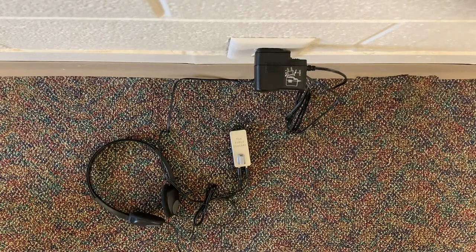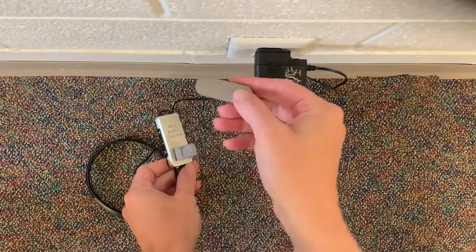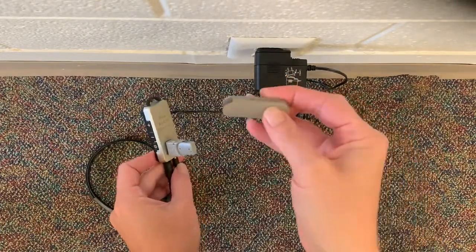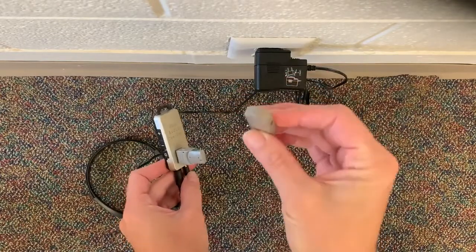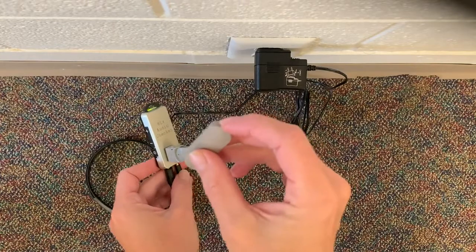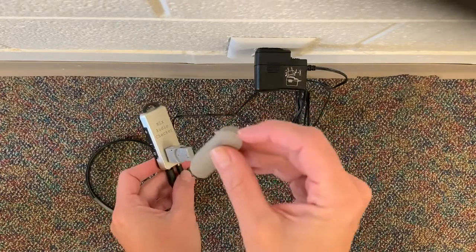You are looking at the audio checker, which is a good way to check if the sleeve for the Medel processor is working. This particular one is called the Roger 21, so it does not have the Roger X on the bottom, but you can do the same thing with the one that does have the Roger X on the bottom.